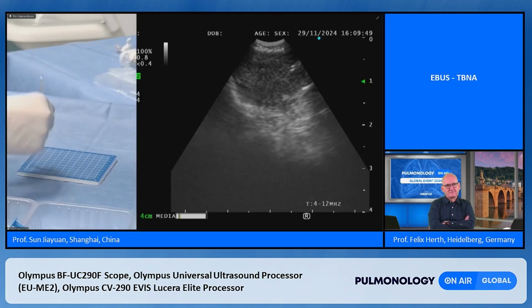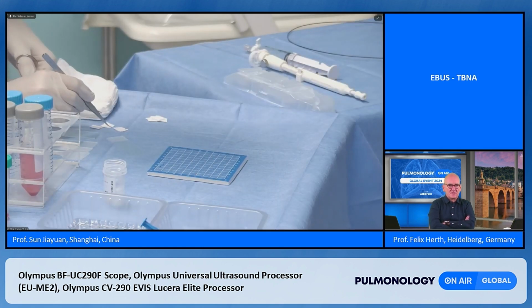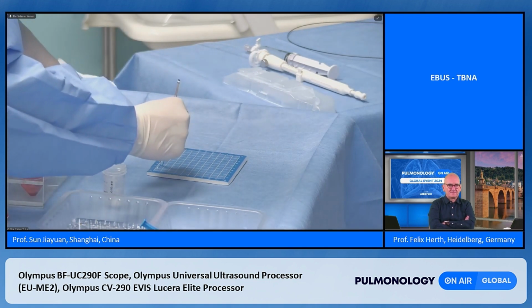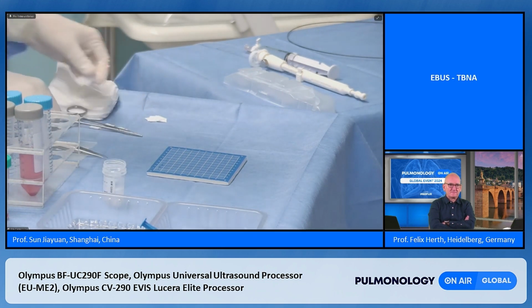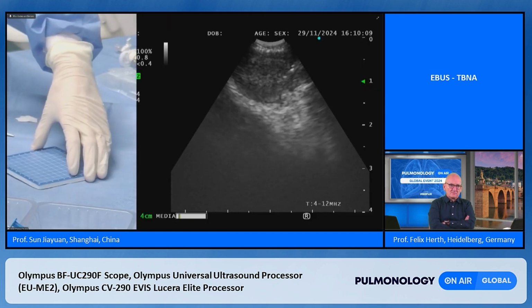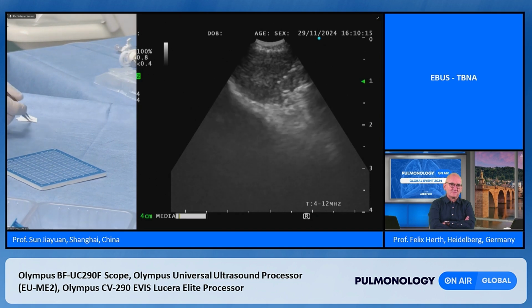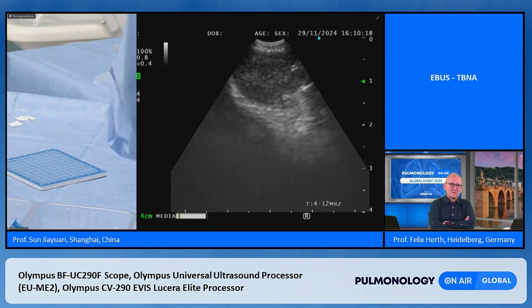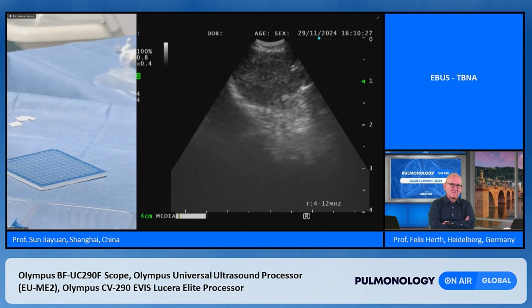那个标本能看一下吗？给他们。现在就看。You see in the EBUS image, the tip of that stylet is still in place. 好，张开了，我往里进了啊。Good. 1, 2, 3. 有了。4 times. Okay. Yeah. We smear the specimen on the slide to perform ROSE. We have finished 4 forceps specimens. We got three specimens by forceps.